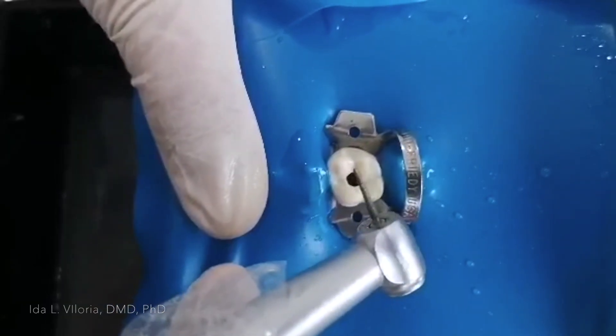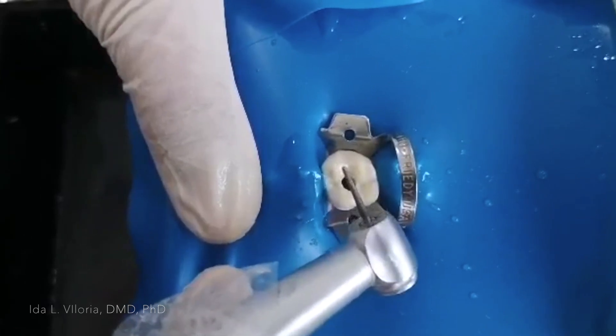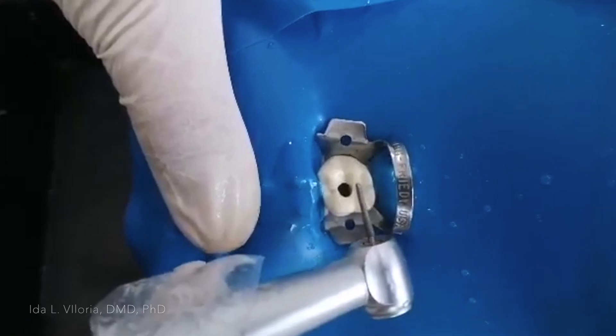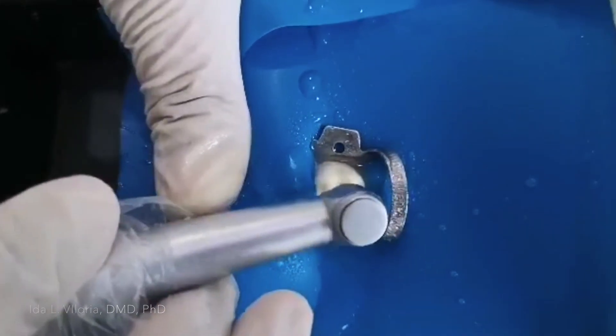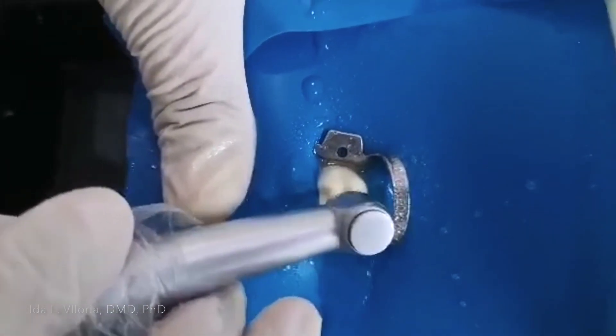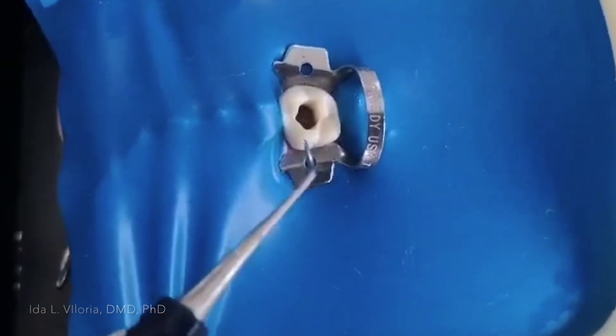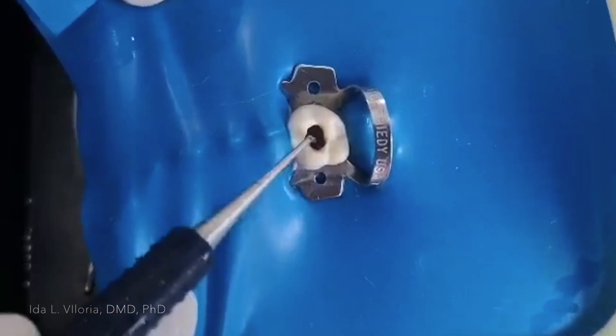After I have unroofed it, I'm now going to smoothen the walls using the long tapered fissure burr. After you have smoothened the walls, try to locate the orifices.